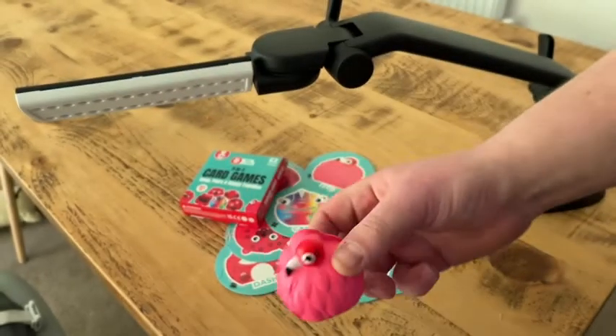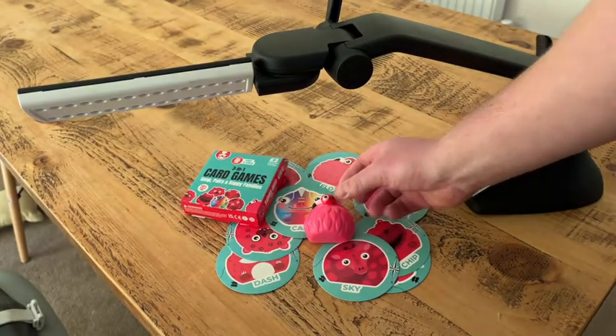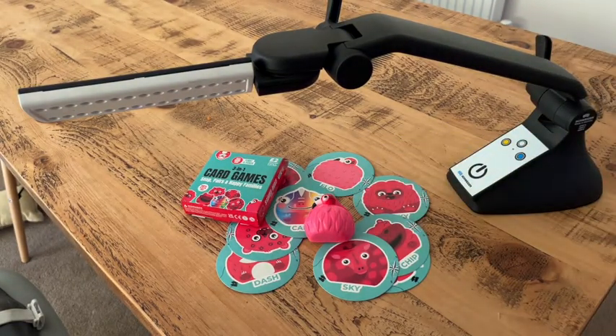Happy Red Nose Day everybody. In this week's Problem Solved, we're going to be looking at lighting, and specifically low vision lighting. Most people are familiar that if you have low vision you would probably benefit from starting with an optical or glass magnifier, but not everybody's aware that the lighting where you're using that magnifier is equally as important. In fact, it can make such a difference that it can actually reduce the level of magnification that you need, therefore getting a bigger field of view.